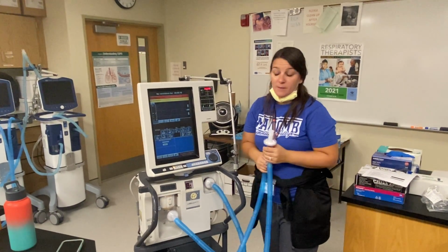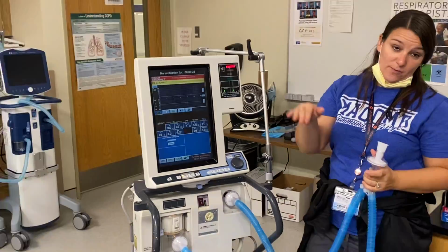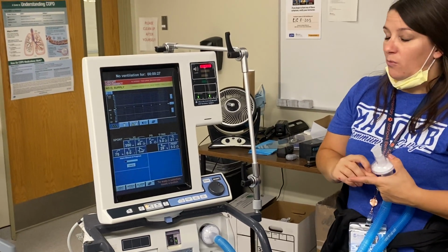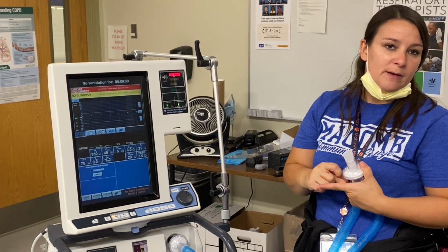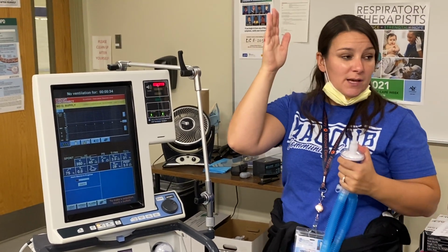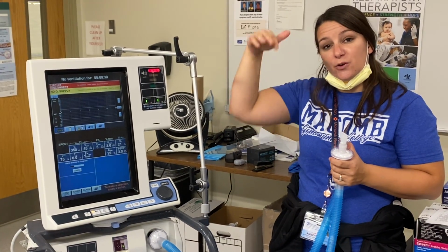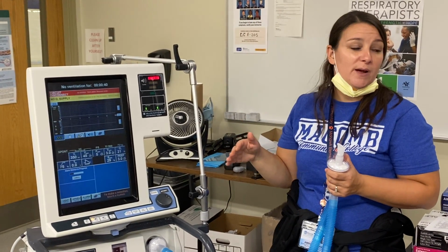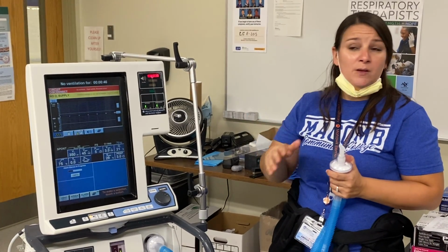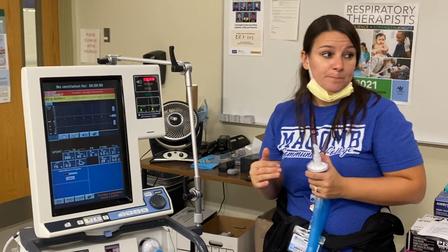That's rise time. Now e-sense controls the end of the breath. That determines when your breath should end. With your COPD patients, it's usually set higher, but if you see a spike at the end of the breath, that tells you that your patient's trying to exhale, so you may want to increase it. If you see a scoop at the end of the breath, that may say your patient's still trying to breathe in, so you may want to decrease it, okay?